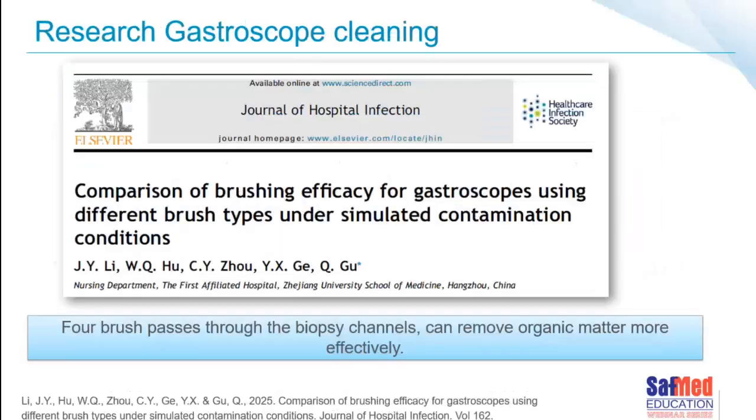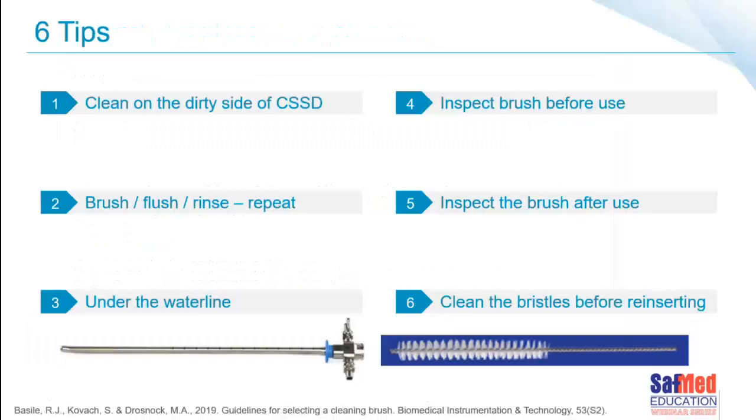Here's another one. This focused on cleaning gastroscopes specifically, also looking at different types of brushes and different types of motions. And in this particular research, which was published in 2025, they found that when you pass the brush through the biopsy channel at least 4 times, that's when you got the most effective removal of organic materials. I wonder how many times we pass through the brush when we're cleaning our flexible scopes here in South Africa.